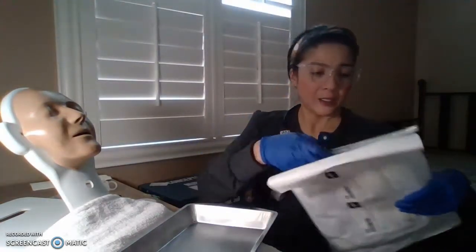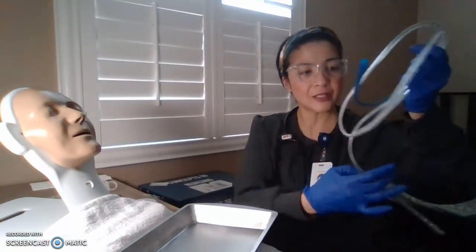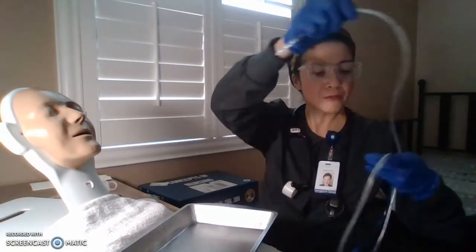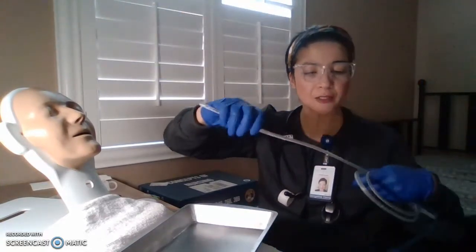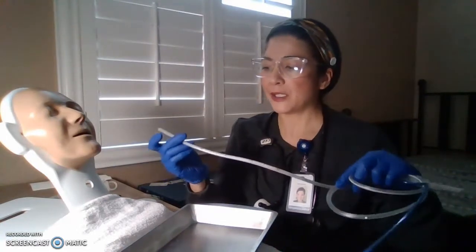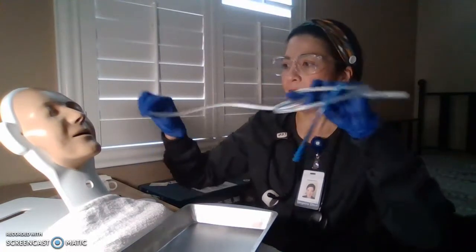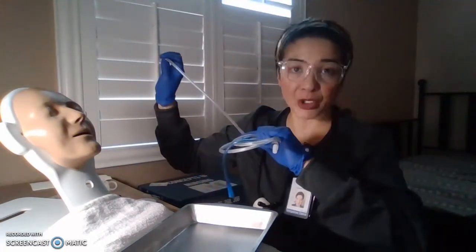Making sure that they are comfortable, you have to ask them. All right, so Mr. Sunny, I'm just going to measure how long of a tubing will go in. All right, so let them know every step of the way. All right, and how do we measure?